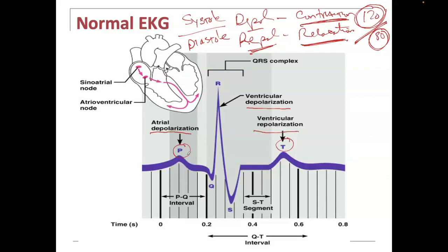So if we look at this little wave right here, look at the contraction size when the atrium depolarizes. So that means when this atrium contracts, we see this little bump. Why do we see just a little bump? Well, in comparison, the atrium is on top. So remember, gravity itself can dump a lot of blood from the atrium into the ventricle. Then we need a little bit of a contraction to push the rest of it out. So we see a little bump.